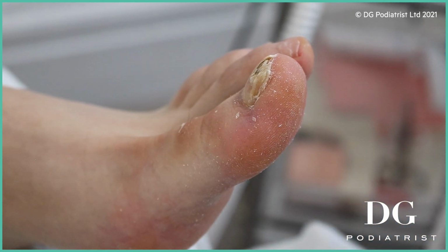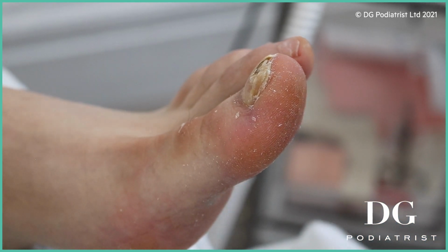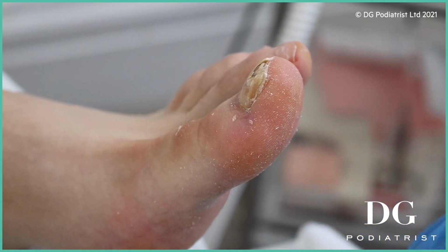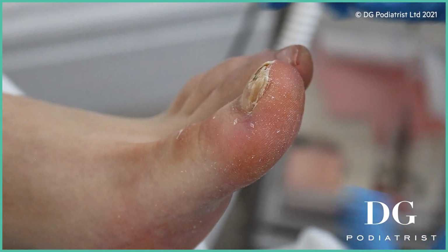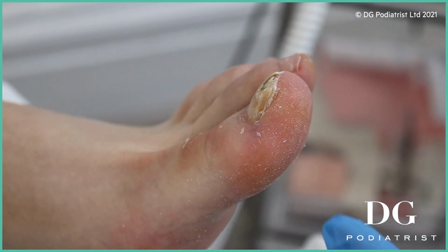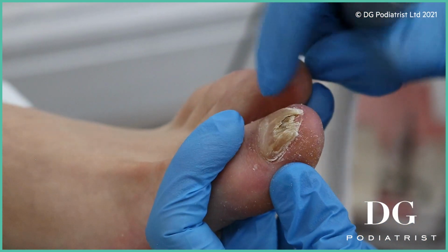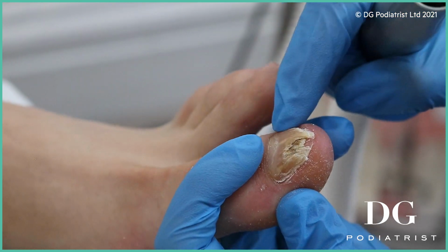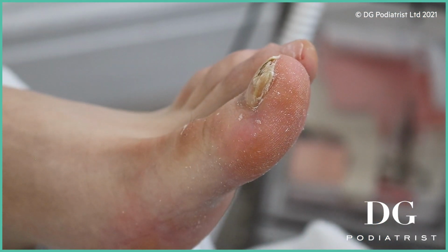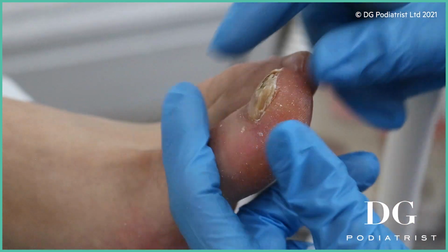Now the second part is putting some of these micro little dents in it. I'm not going to call them micro holes because we're not penetrating all the way down to the nail bed, but they become like little pockets, so the product penetrates better, and as you can see the color of the nail gets a lot better throughout rather than just having a one-off patch here and there. There we go.